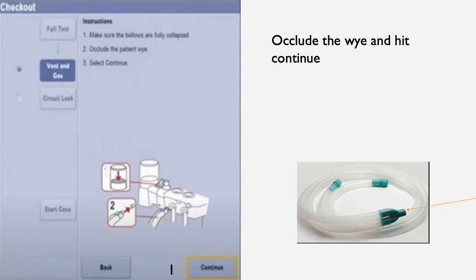Next to the flow sensors is a little stump called a leak test plug, labeled number 1 on the diagram. Place the Y on this plug to occlude it, then press continue. Time will count down from about 2 minutes and 30 seconds.